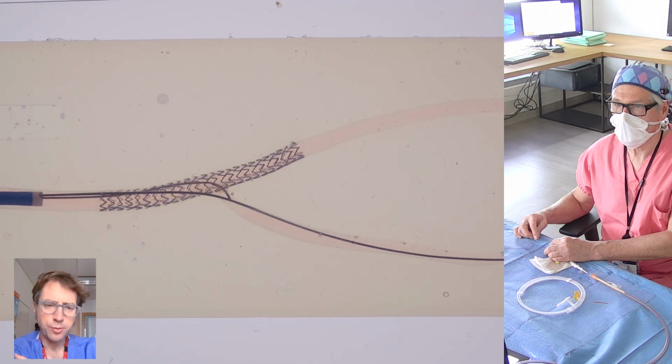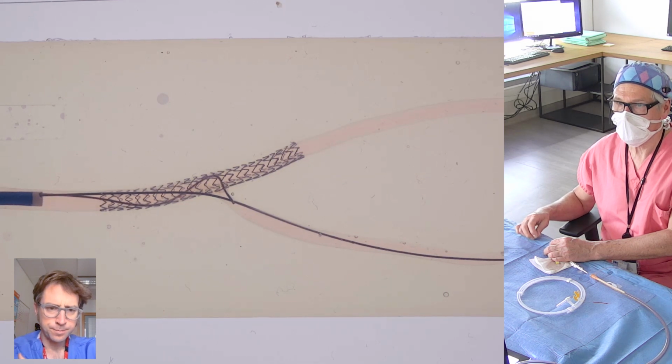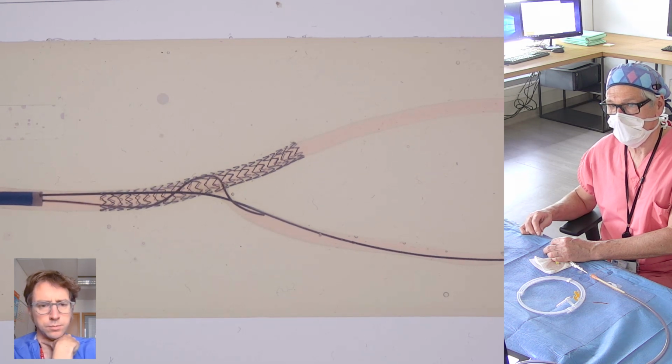Very nice. It's beautifully recreating the images we had in that caudal projection of the wire. Yeah, exactly. And it's important to note that, albeit this is a model, that's the point at which dissecting a side branch becomes a real concern, and so there has to be care with the wire. Yeah, this is why we usually do not do any predilatation in the side branch, because you create some dissection and you may increase the difficulty.